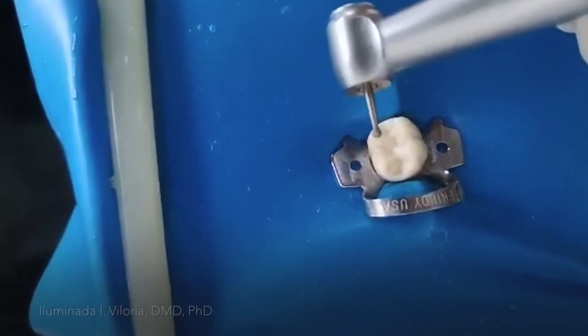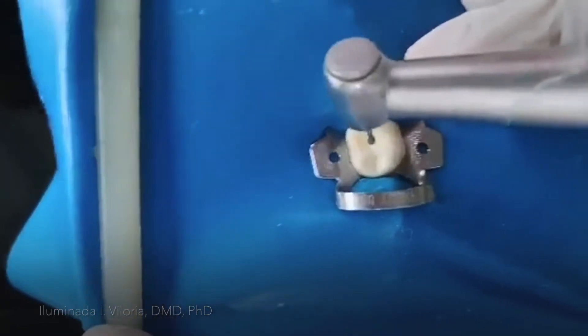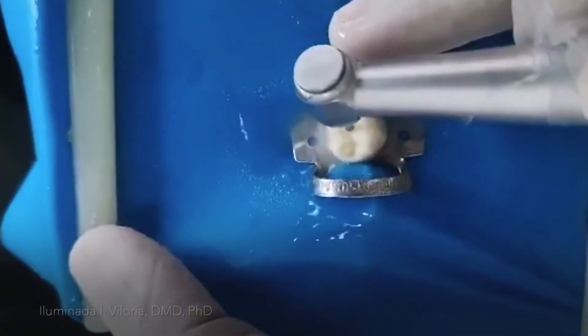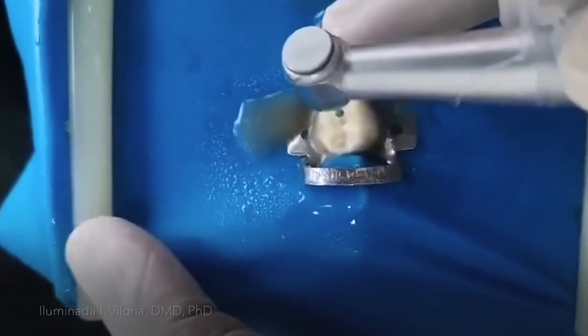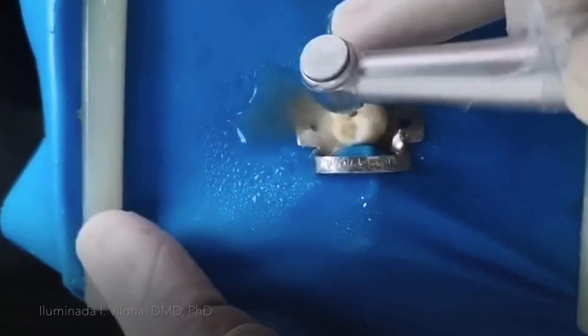I'm using a round burr — number 4 round burr — and start drilling at the center. Don't forget to measure first the distance from the cusp tip to the roof of the pulp chamber.